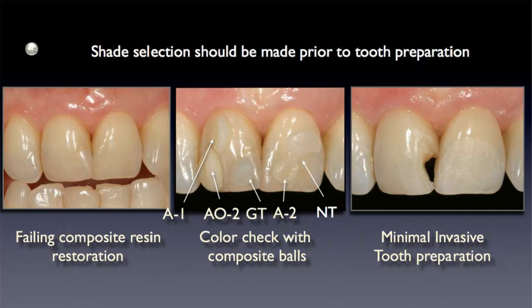And then from there, I'm using minimal invasive tooth prep. You can see how it's been very minimally invasive. I virtually just take out the restoration, and then I just refresh the enamel tags, the enamel surface, so that I'm able to then bond to it much better.